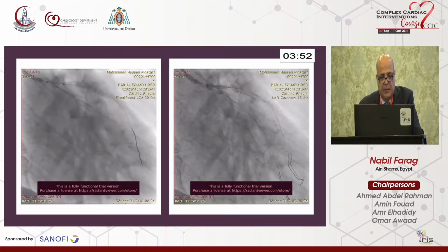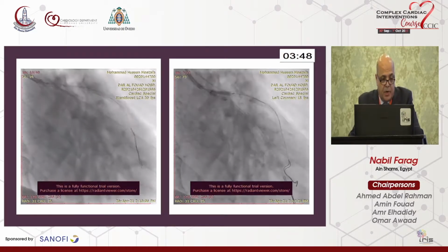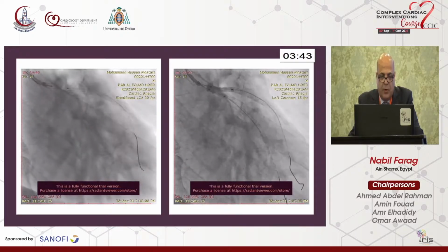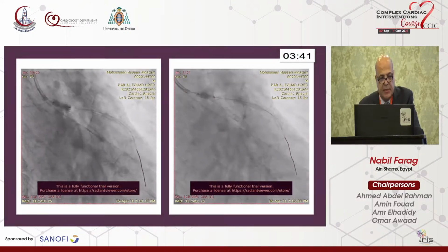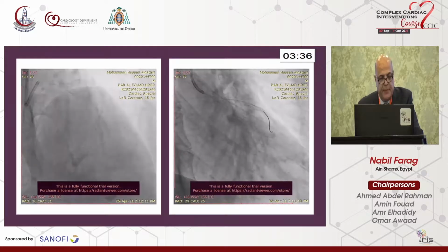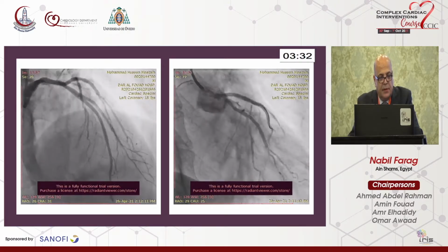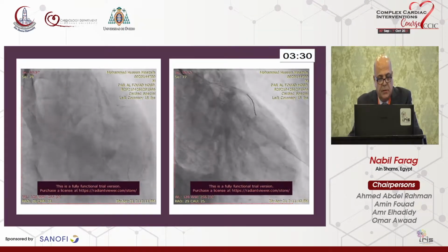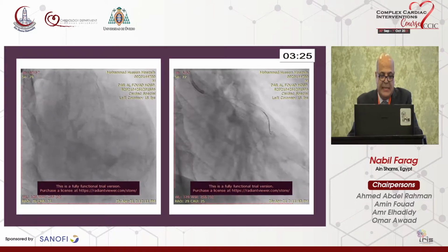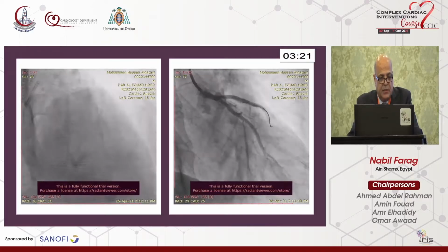And in left main intervention, you have to end up with proximal optimization. Final kissing inflation should be followed by proximal optimization. That's why I did the final POT for the left main with these final results as regards the LAD diagonal bifurcation, the left main LCX bifurcation, and a provisional stenting for the circumflex obtuse marginal bifurcation.